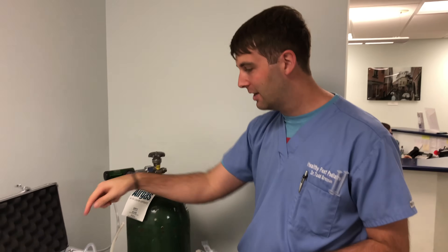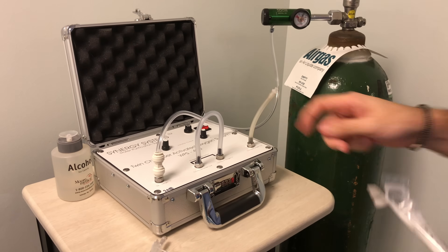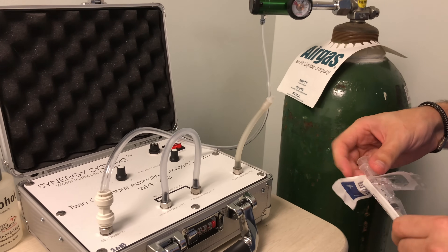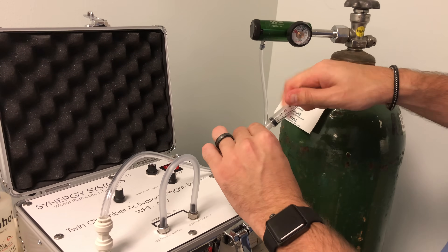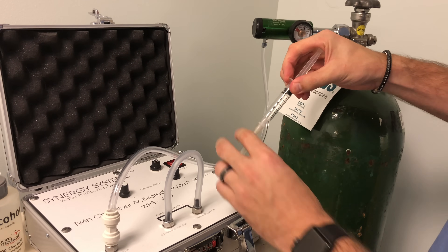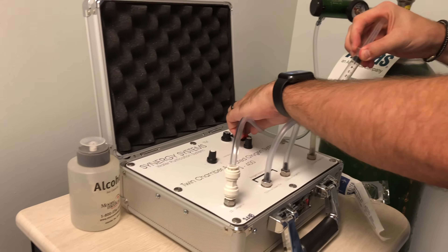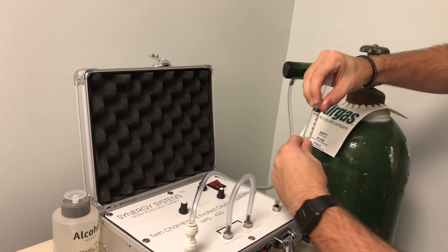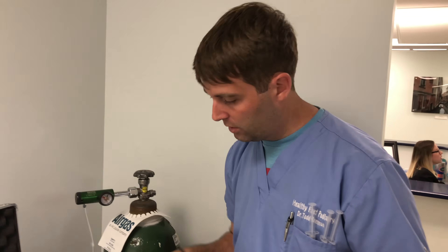Here we are — this is our oxygen tank and our system. We turn it on and it starts cycling the oxygen from O2 to O3. It does have a pretty bad odor, believe it or not. We hook it on here and you can see how it pushes out pretty quickly — if you don't hold it, it's going to hit you in the face. So let it fill up a little bit, turn it off, you'll hear it give a little bit, and then we hook it right up to the syringe. So now we're ready with those two — we're going to go in and see our patient.